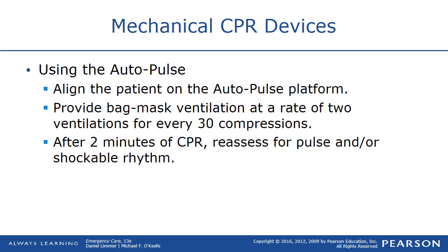There's another one called the AutoPulse. You align the patient on the AutoPulse platform. You provide bag mask ventilation at a rate of 2 ventilations for every 30 compressions. After 2 minutes of CPR, reassess for a pulse and shockable rhythm.